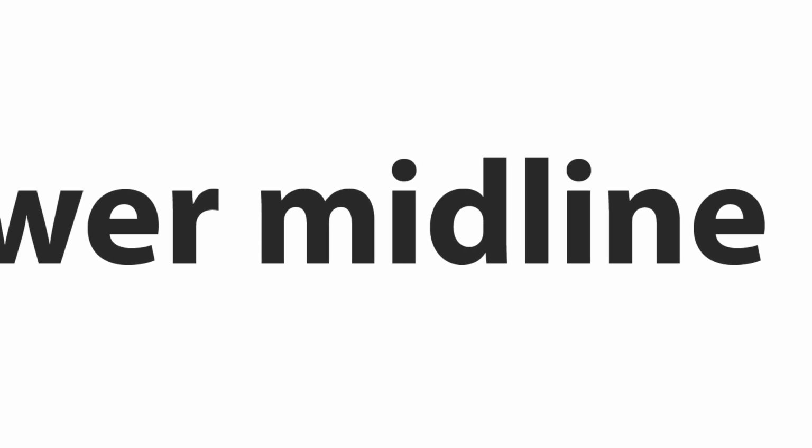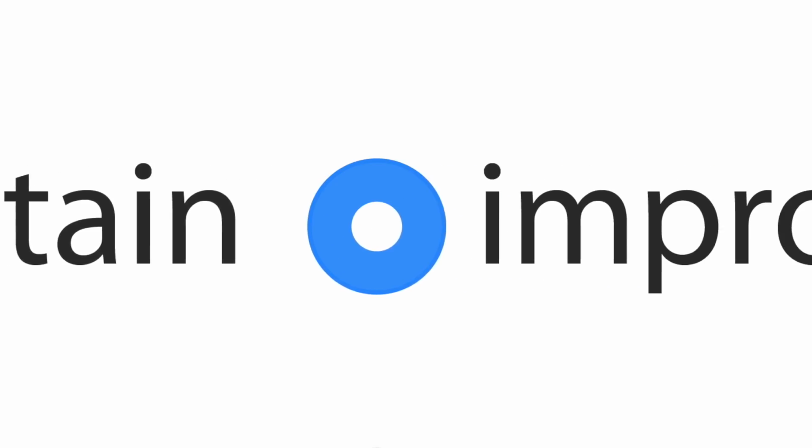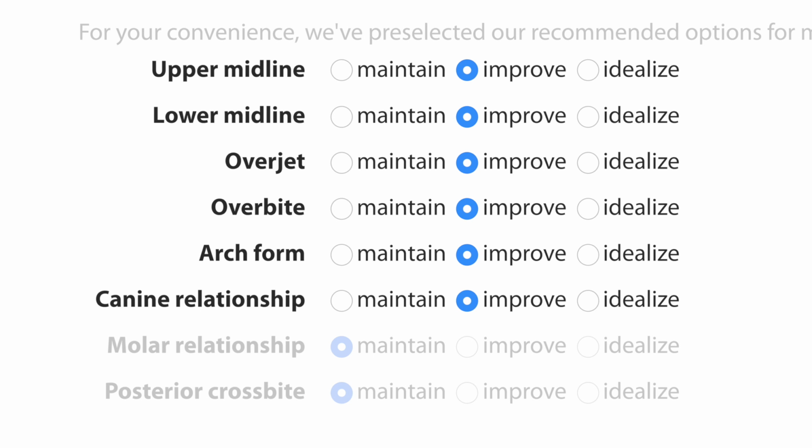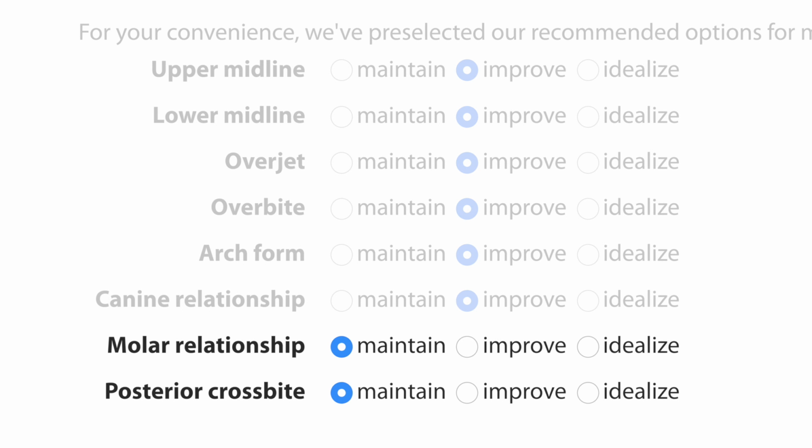In the next section, you choose whether you want to maintain, improve, or idealize various conditions. The default option for most conditions is to improve them as much as reasonably possible within the selected case type. The molar relationship and posterior crossbite are difficult to adjust with clear aligners alone, so we maintain the existing condition by default for those conditions, rather than planning movements with a low chance of success.